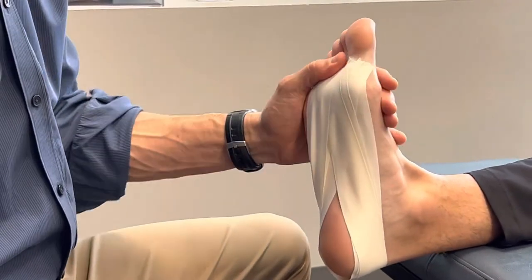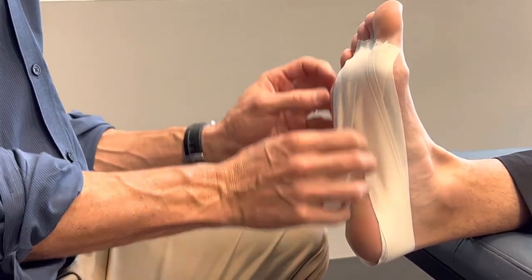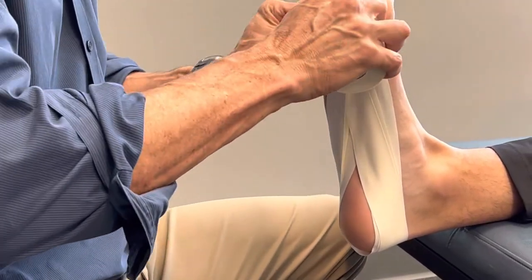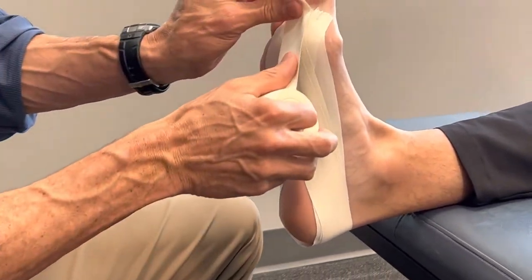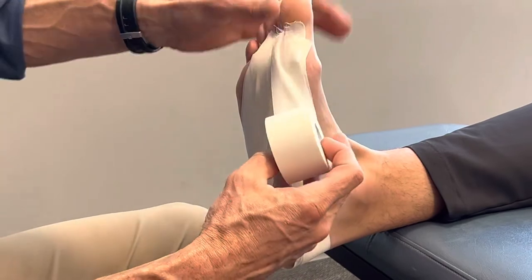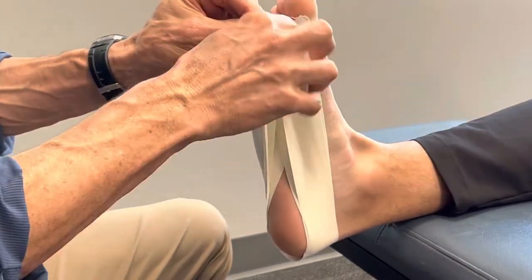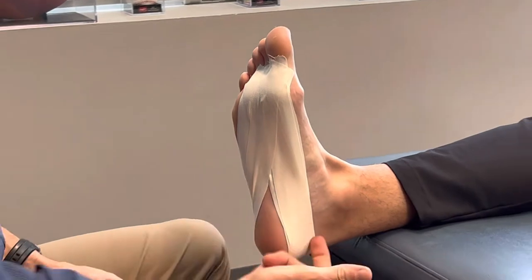One problem with this technique is you can't do it to yourself — it is impossible. When you apply it, you don't want these strips to have holes or ridges in them, so flatten them out as best you can. Lastly, I would do one more strip on the first toe because that's the most important one — we're usually stressing the plantar fascia on the inside, and that's usually where people have the most pain. Find a different spot on the heel, tack that down, and come back to the same spot.